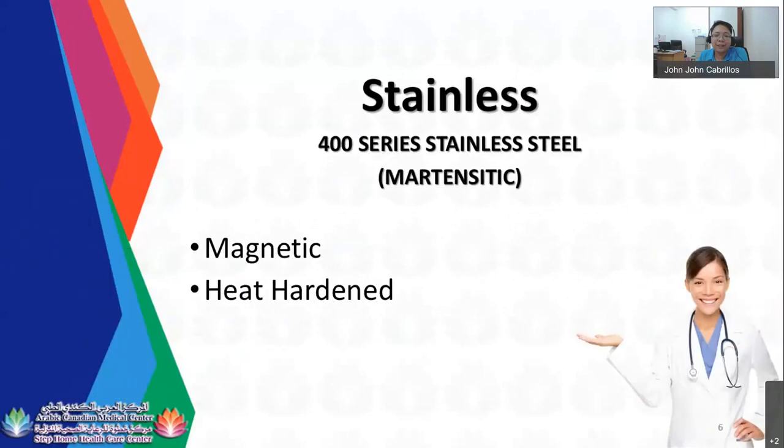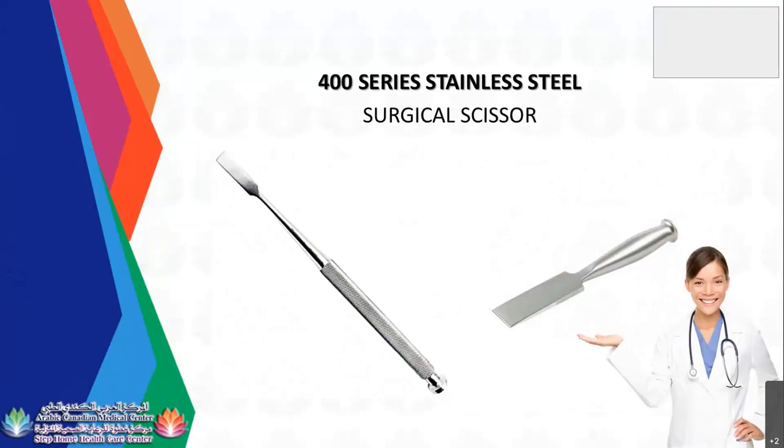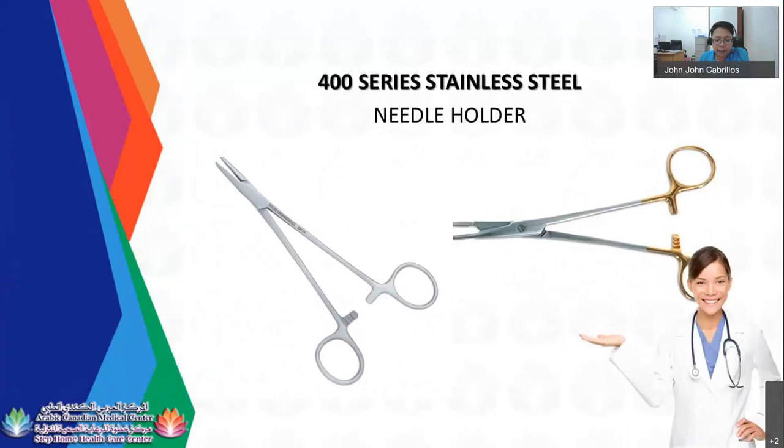400 series stainless steel is actually magnetic. The metal is magnetic, and it is heat hardened. Samples of 400 series stainless steel are your surgical scissor, osteotome, hemostatic forceps, and needle holder.